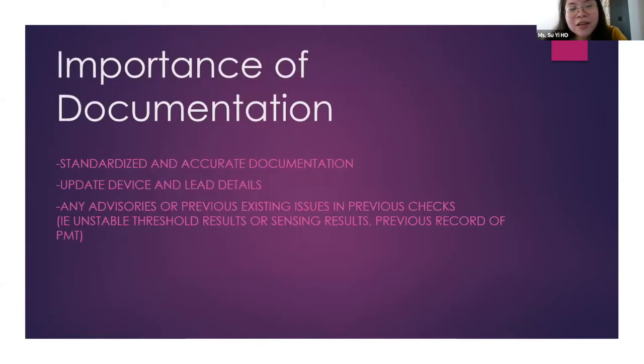Okay, finally, this slide serves as a personal reminder to me that even though we are so busy with checks sometimes, it's also important not to neglect the paperwork process. Proper documentation of test results, lead details, the patient's history, or any existing alerts or advisories will help ensure a better handover to whoever is doing the check subsequently, as all these checks tell the story of the patient's condition.